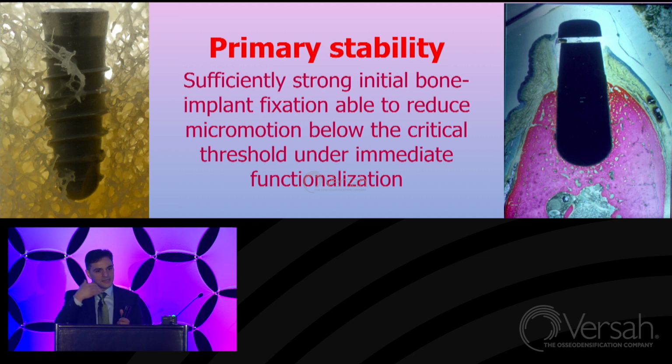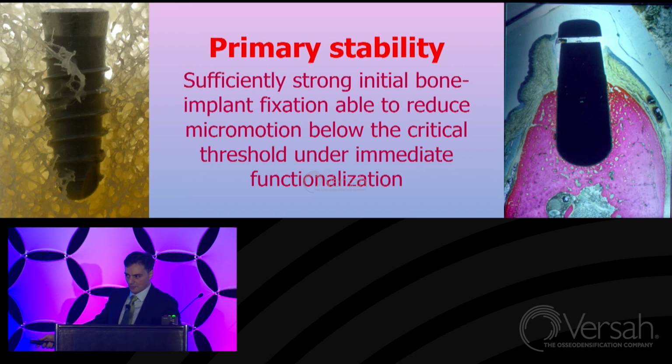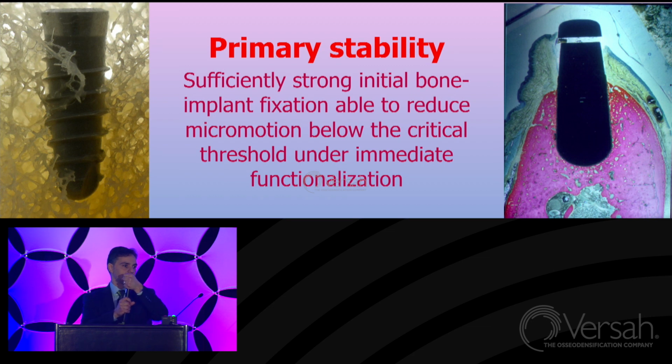ISQ is an indicator of the implant stability indirectly. It's not a direct indication. It's a surrogate measurement. And the critical threshold of micromotion, which was studied in orthopedic experimental animal studies, is between 50 and 100 microns. And it is related to how much force we apply during chewing in the occlusion function.